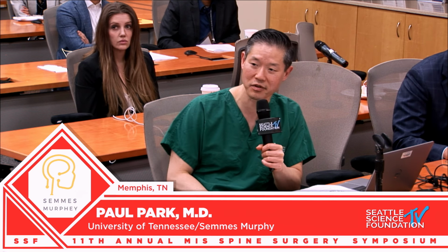Like if you're doing C6-7, for example, you can't see the spine at all. Yeah. Maybe just on the AP, but just can't see. Well, C6-7, my kids would be laughing right now because 7-8-9, right? So, yes, C6-7 is hard. C7-T1 is difficult, right? The shoulders are there. Pierce showed us some tricks that we're going to all use. I'm sure he's going to comment on that. It can be really difficult.